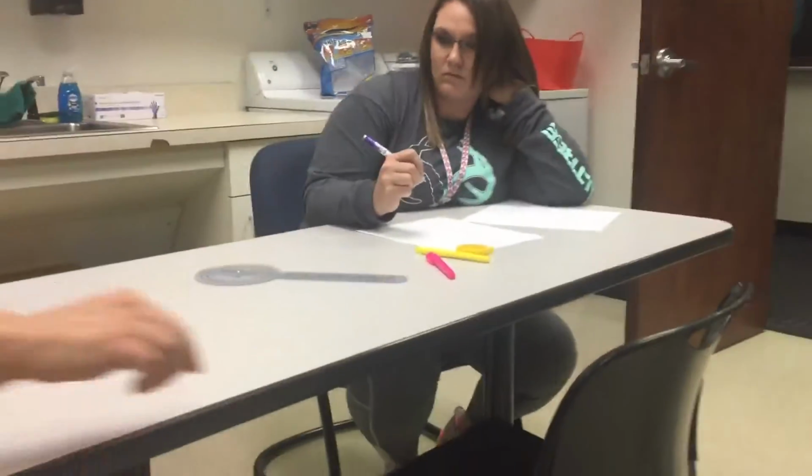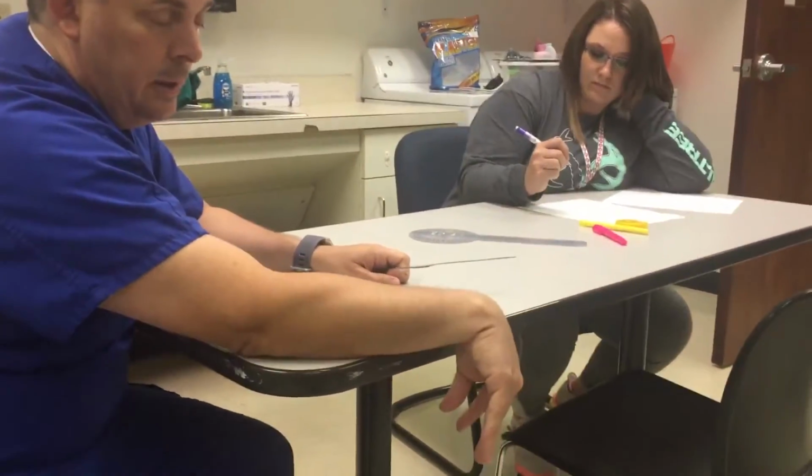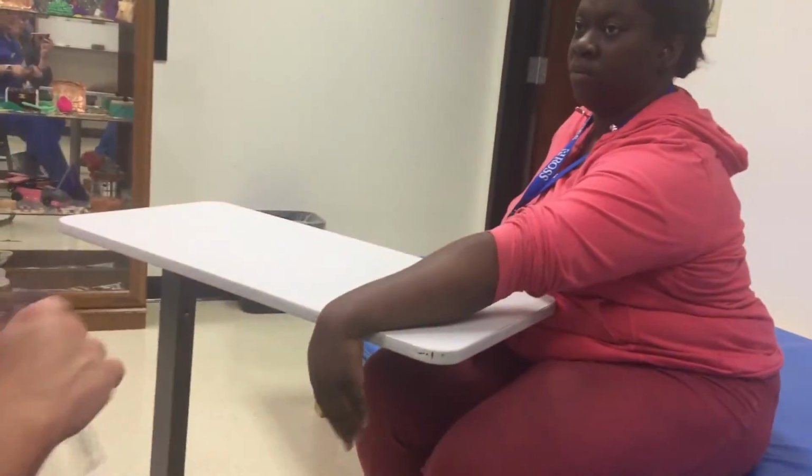So what I would normally do is have them on the edge of the table like this, at an angle, to where they can fully free fall the wrist, right? We can't really do that with how she's positioned right there. So you would have them sitting at the table like this.